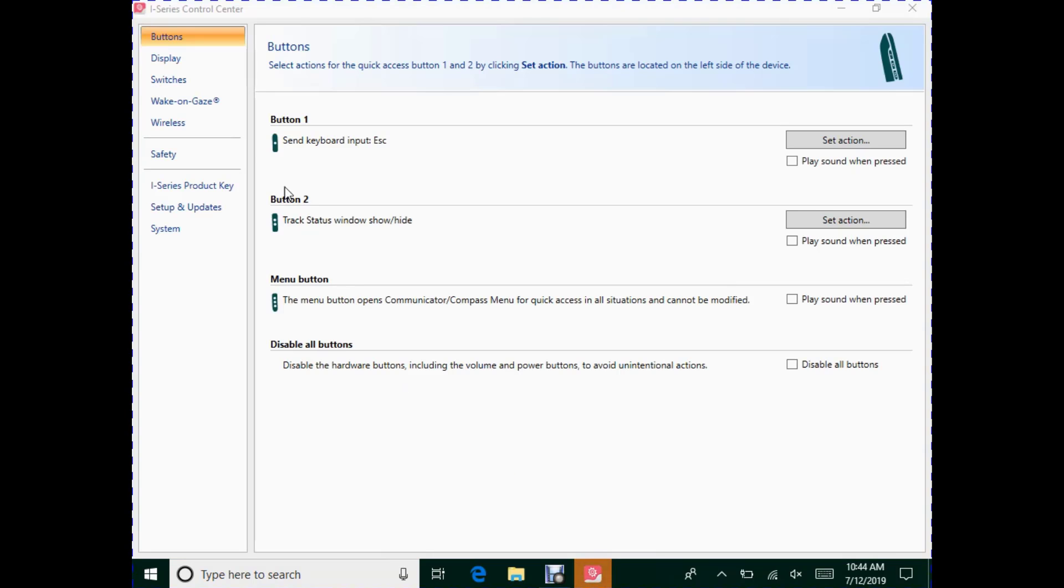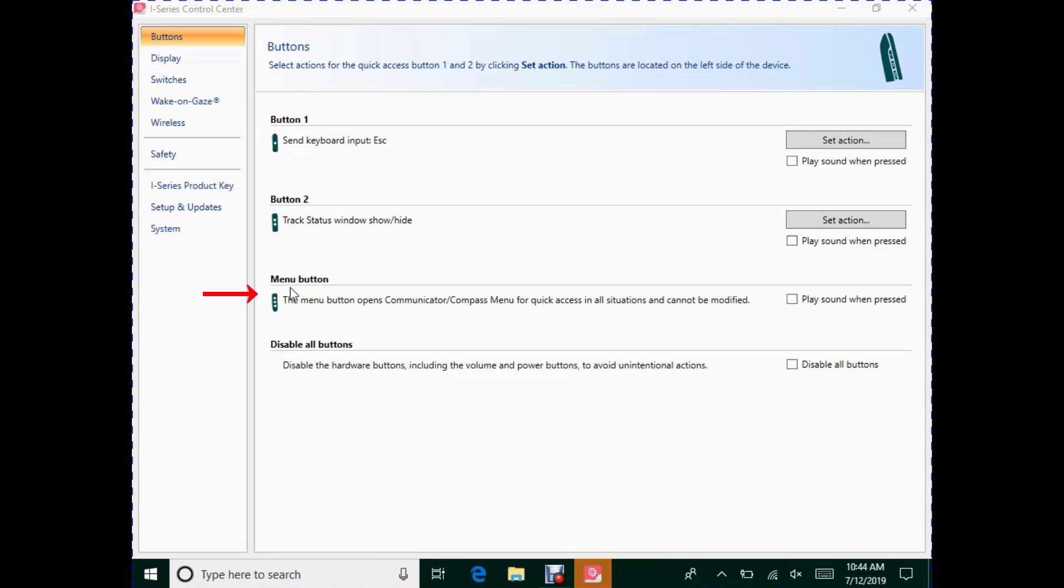Once Control Center is open, select Buttons at the top left corner, and on the right you will see your button options. You will see button 1, 2, and the menu button. The menu button can never be changed—it is the menu button for Communicator and Compass.